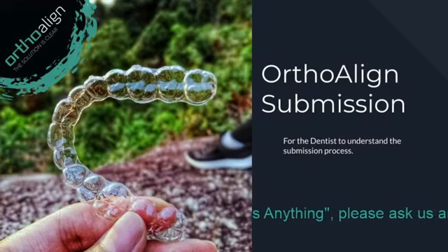So it's important to avoid pictures that are overexposed, pictures that are dark, and frontal pictures that are not using a cheek retractor, for example. These are not very ideal pictures. If I were to jump back, these are the type of photos that you'd want to take. Very clear. You can see all the dentition, the focus is good, the lighting is perfect. So this is how you want to take the photos, and please, we do not accept photos like this.